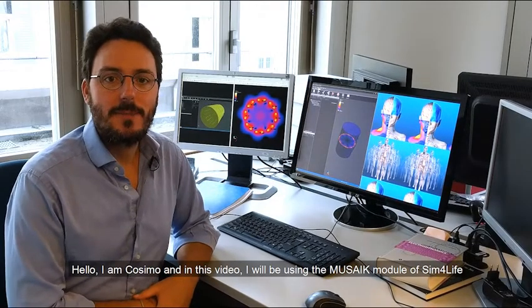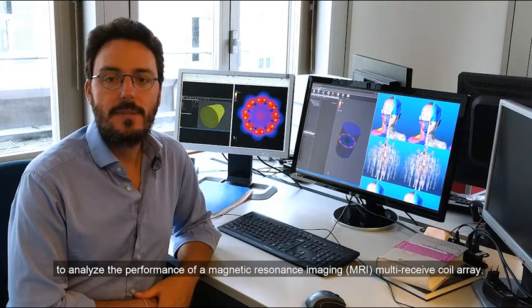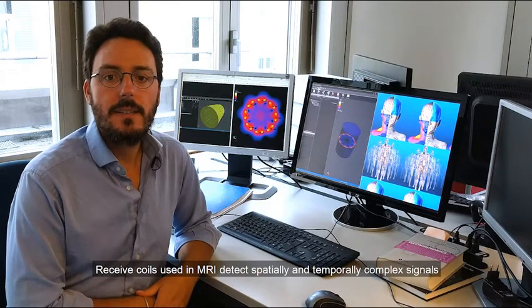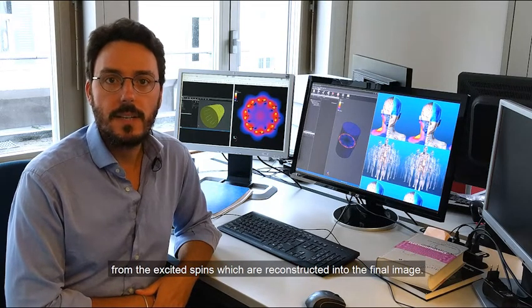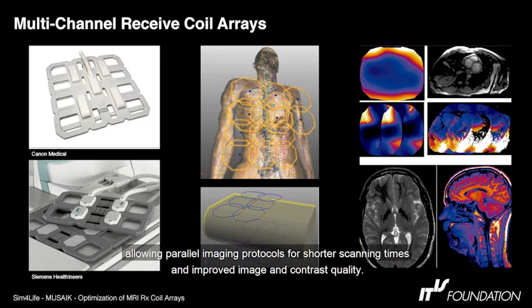Hello, I am Cosimo, and in this video I will be using the Musaik module of Sim4Life to analyze the performance of a magnetic resonance imaging multi-receive coil array. Receive coils used in MRI detect spatially and temporally complex signals from the excited spins which are reconstructed into the final image. Multi-channel receive coil arrays are an integral component of modern MRI systems, allowing parallel imaging protocols for shorter scanning times and improved image and contrast quality.